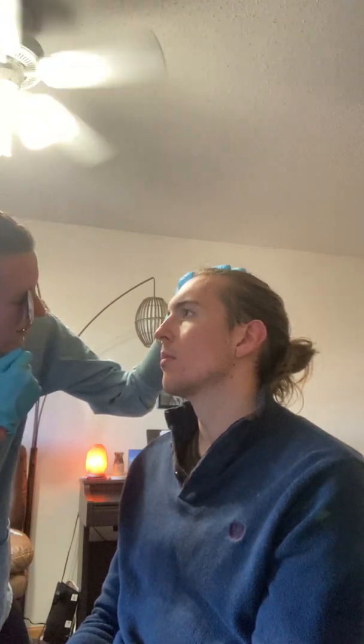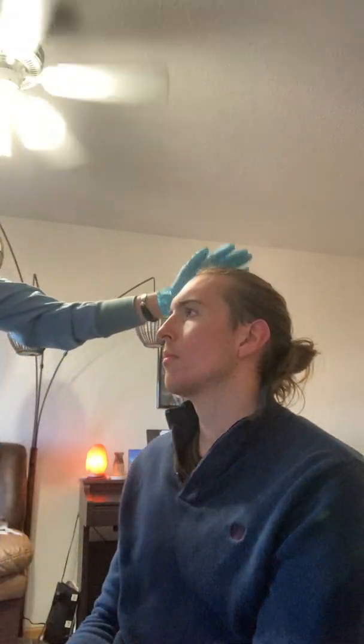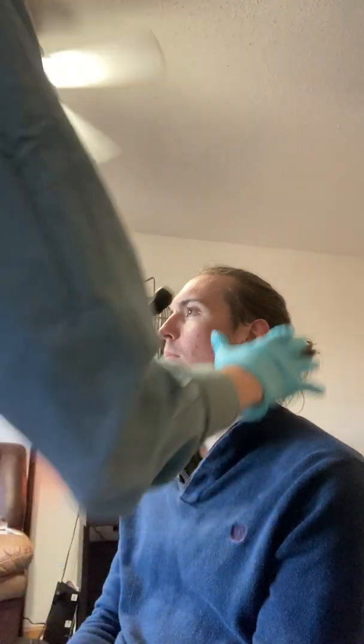I'm noting your fovea and your macula, and your optic cup and disc. I'll go ahead and do this side as well, holding my scope in my left hand, placing my right hand on your head to stabilize.